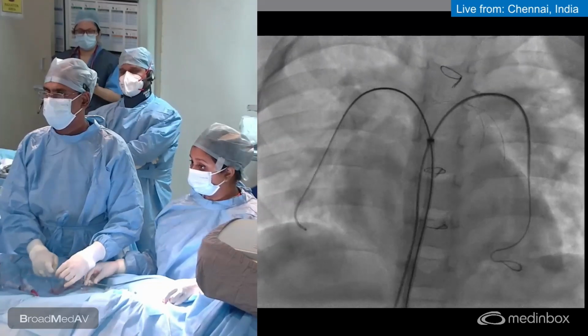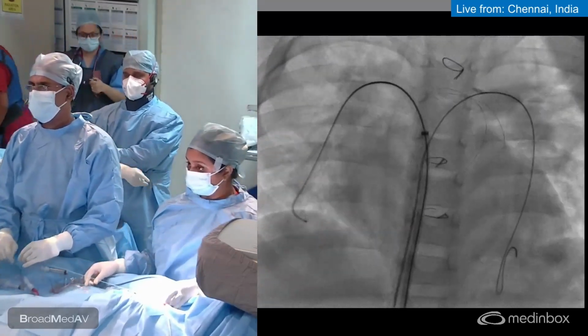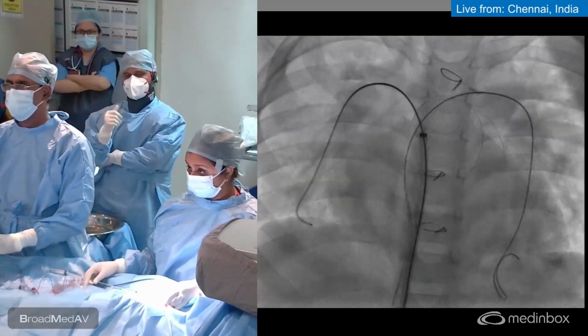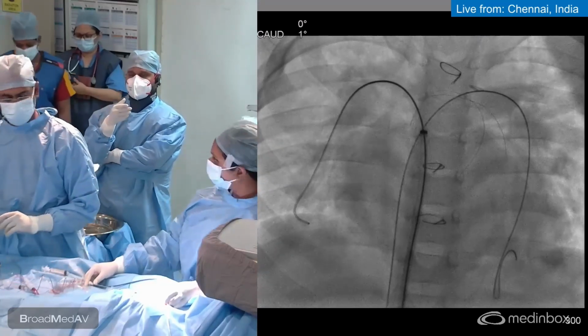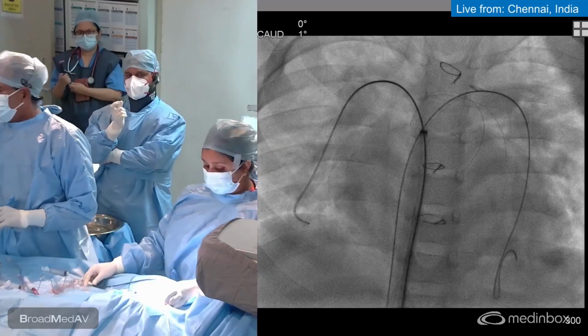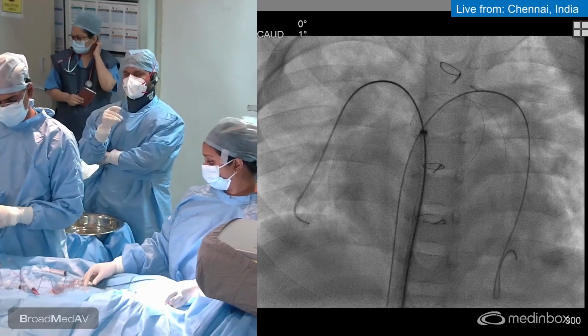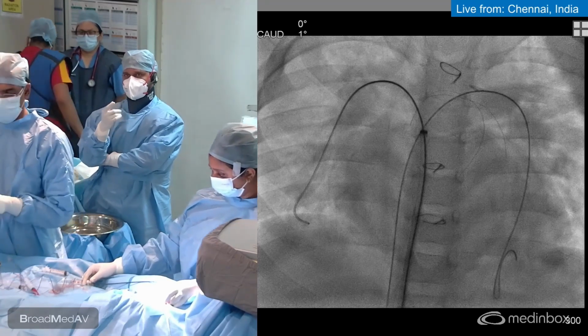Even in the CT, though we could recognize that there was RPA narrowing in the angiogram when we showed here, the RPA at that narrowing is actually oval in shape, and whatever we saw was the vertical component of the oval rather than the shorter axis of that oval. So it is even more narrowed than what we saw in the angiography now.